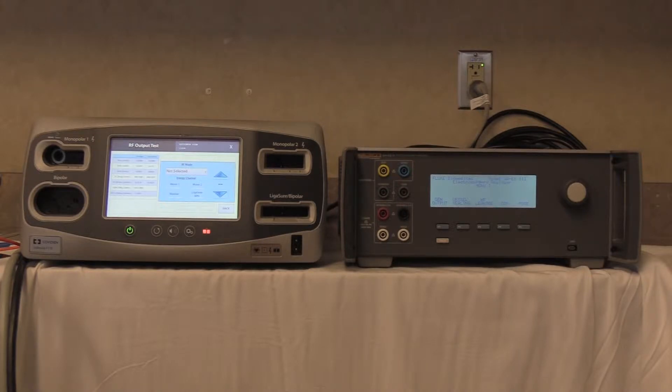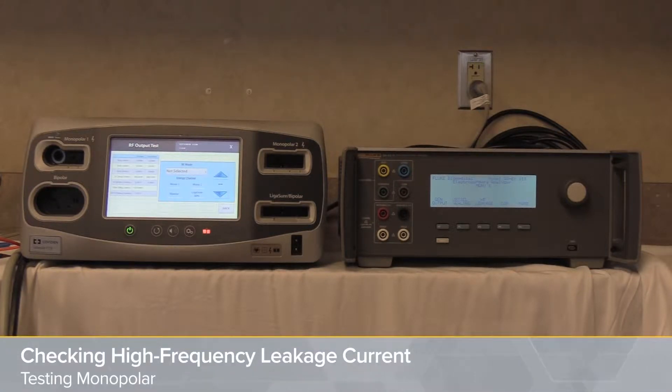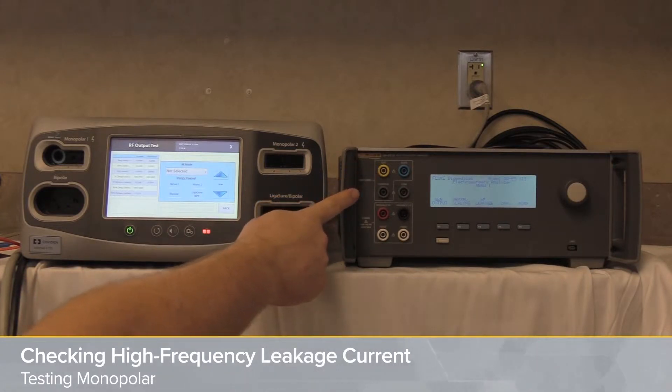Checking the monopolar high frequency leakage current of the Medtronic Cavidian ValleyLab FT10 using a Fluke Biomedical QAES-3.